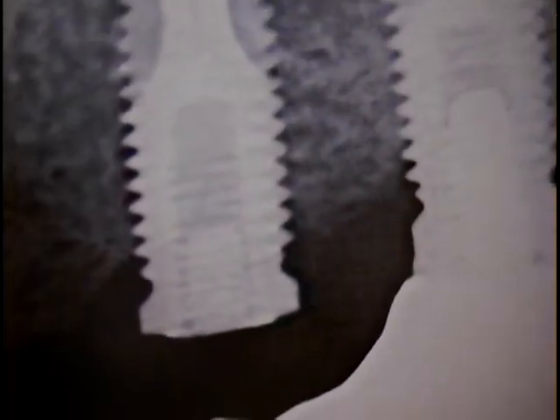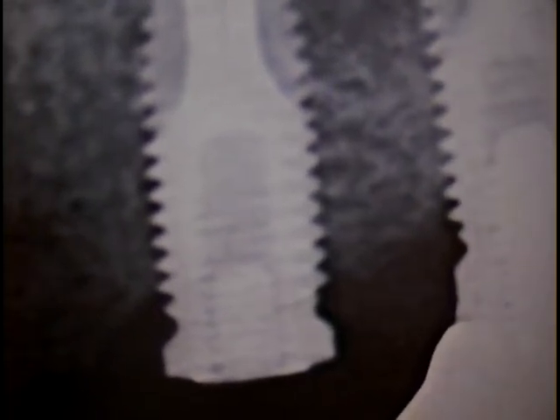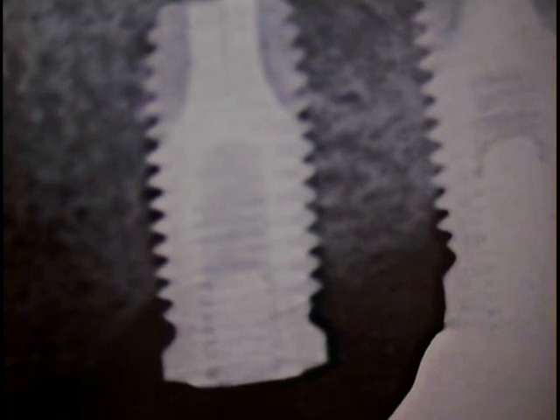Hello and good morning. This is Dr. Jerry Cuomo. I'm here with another rescue case. This is the actual x-ray I'm showing right now. It is a Biomet 3i case that was referred to me by a dentist who practices here in Florida as well as New York City.